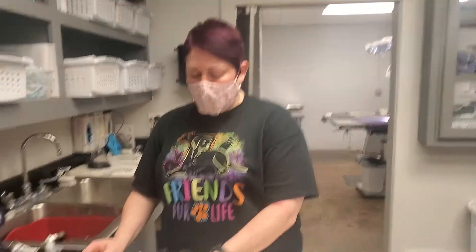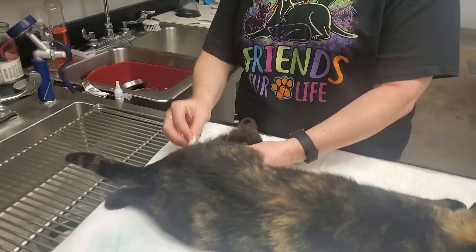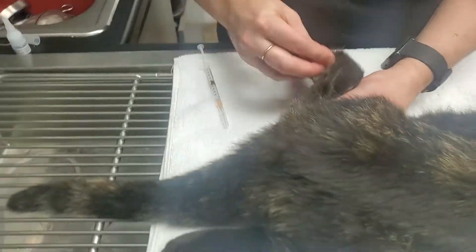I'm Cassie Thasher. I'm going to do a video on how to give an intramuscular injection. I have my alcohol. I'm going to clean the muscle — the area that I'm injecting.